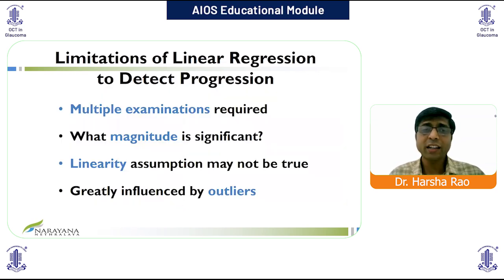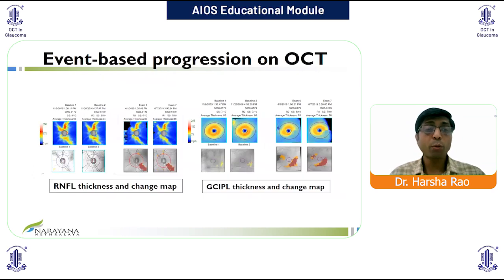However, this linear regression analysis to detect progression also has multiple limitations, which we will not go over. It probably will be discussed more elaborately in other presentations of this module.